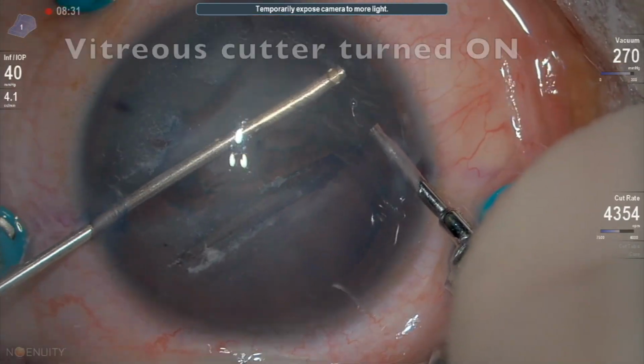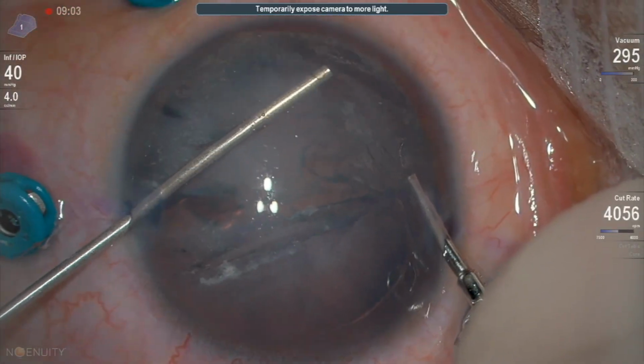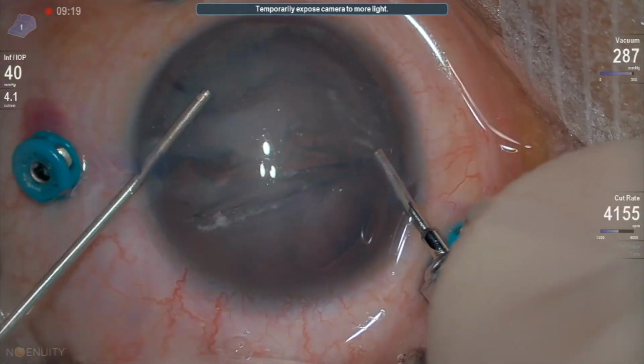Using the vitreous cutter, we remove the prolapsed anterior vitreous from the anterior chamber, taking care not to damage the remaining capsule.